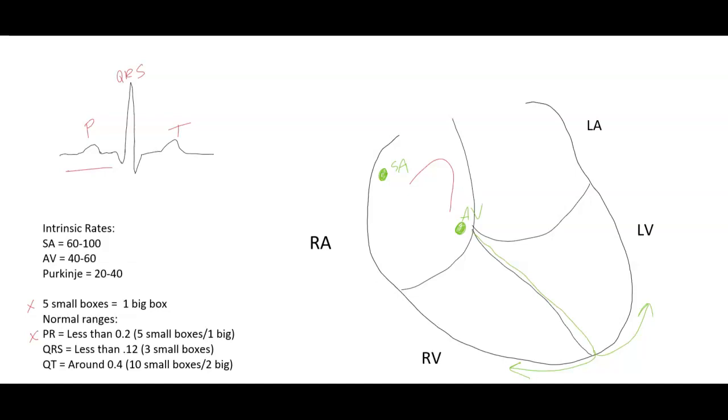To me, if you visualize it, it does kind of look like it would be something that would go down. There's actually 2 little bundle branches there, and they start to go around, and that right there, bam, is going to be your QRS complex. I like to think of the T as kind of going back to the start, a reset, if you will. Okay, and that's going to be your T wave.